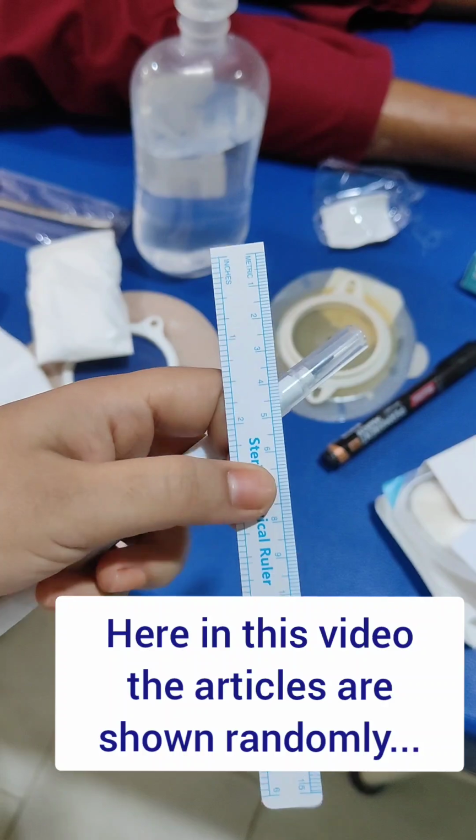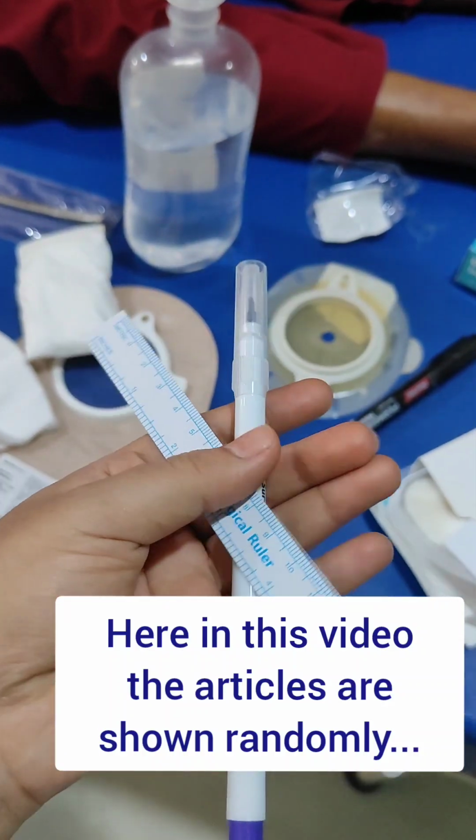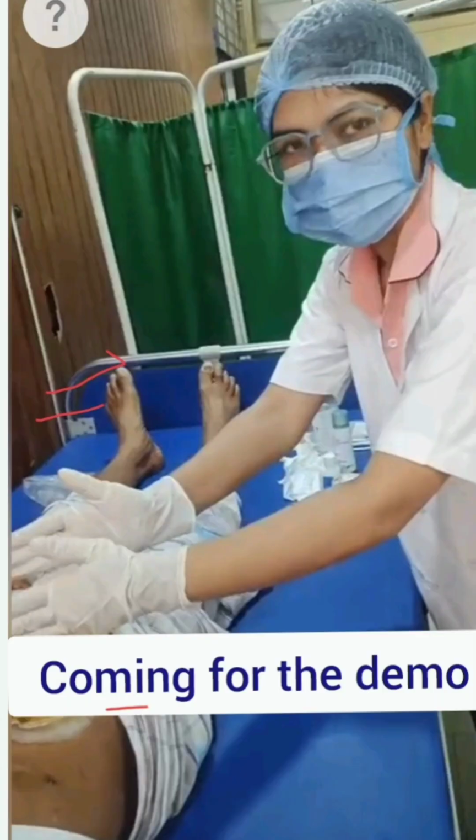Then gauze or soft cloth to clean the area. Okay, then scissors to cut the flange to stoma size. Then disposable paper bag or biomedical waste bag, accordingly it is needed.